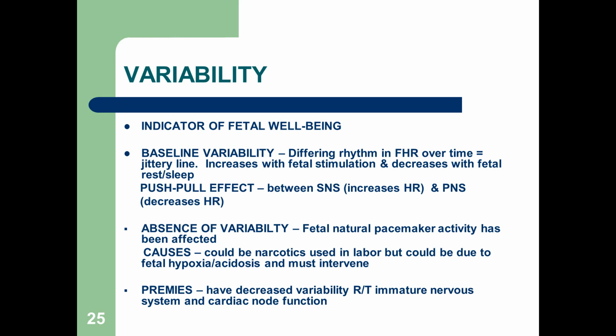Okay, so when you see that variation, and it returns back to the baseline, that's good. And I'm going to show you in class some examples of that, and we have some slides on here as well. Certainly, absence of variability, fetal natural pacemaker activity has been affected. Causes could be narcotics used in labor, but could be due to fetal hypoxia or acidosis. You must intervene. So if you have a flat line or very little variation, that's cause for concern. You have a baby in distress.